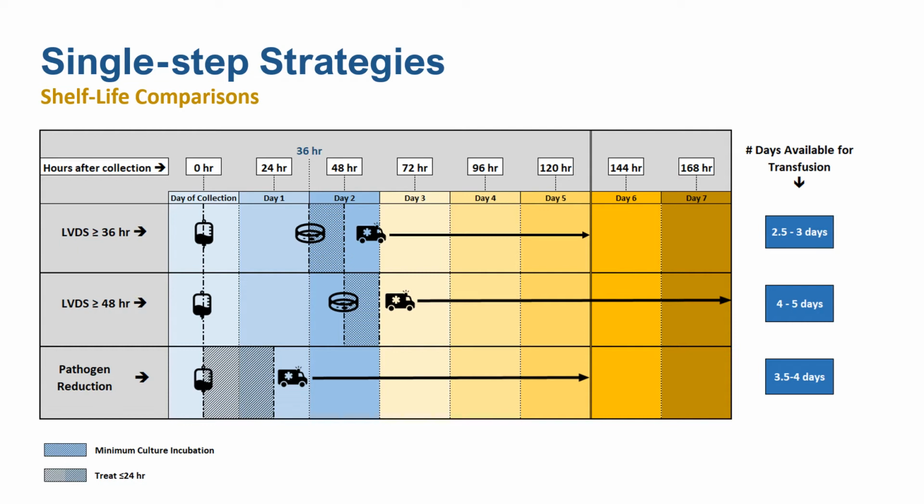Note that some products may require a hold time if shipped prior to the end of culture incubation time. In those situations, inventory controls must be in place at the transfusion service.